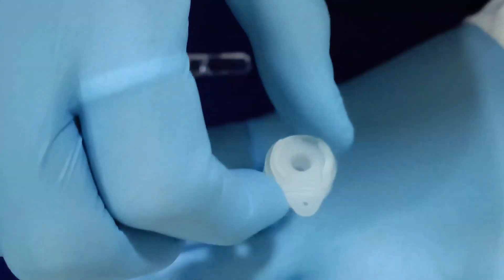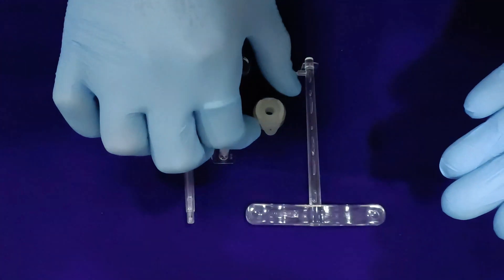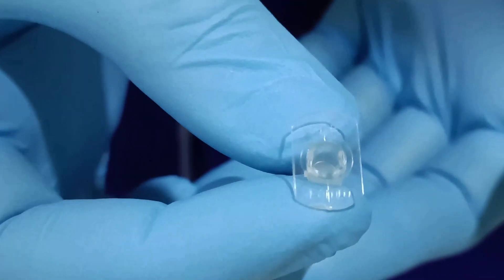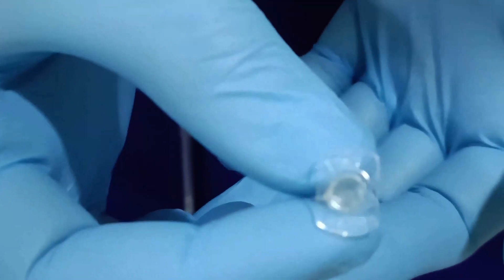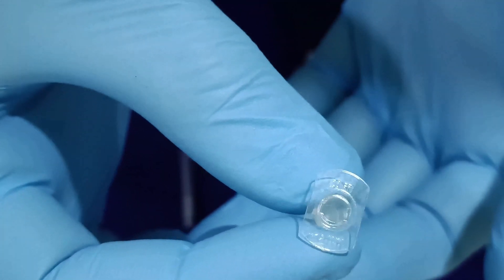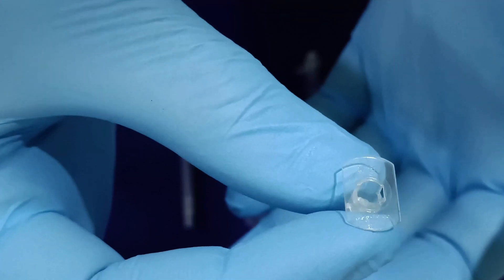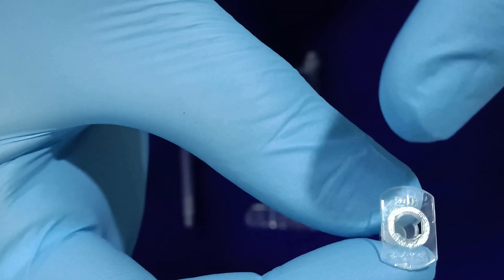This advanced voice prosthesis is a dual structured device with outer and inner cannulas, whereby the outer cannula needs to be inserted by the surgeon and will remain for a much longer period, followed by the inner cannula that can be either inserted by the surgeon or the patient and can be changed at regular intervals rather than changing the whole voice prosthesis device every time.